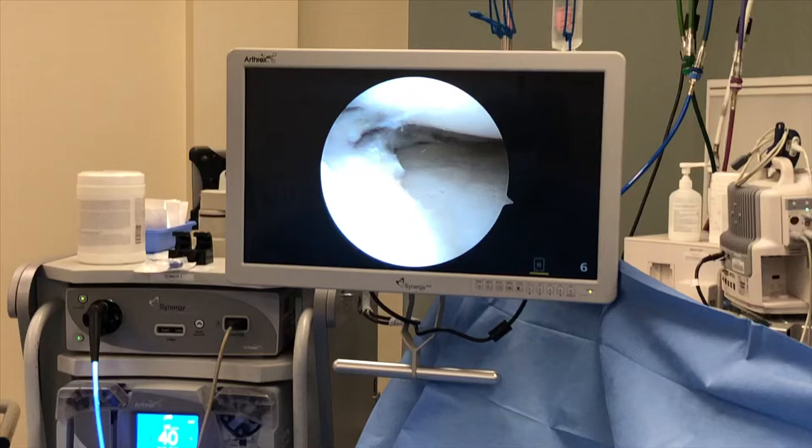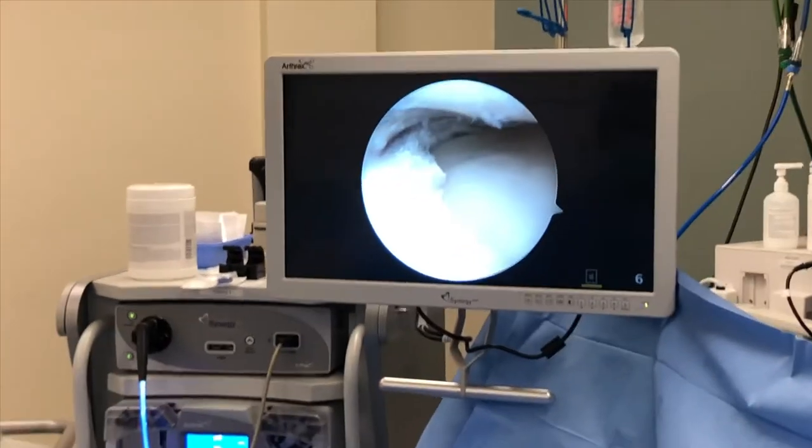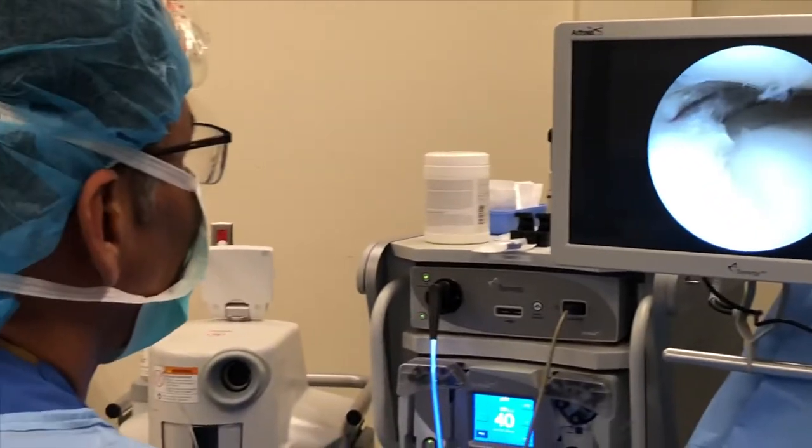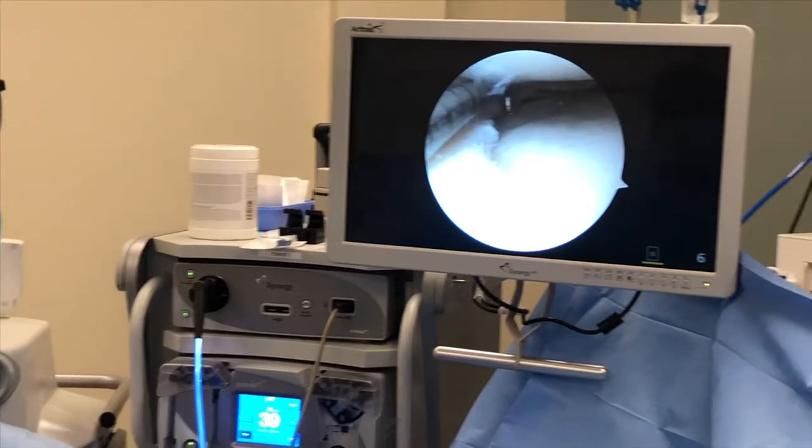I'm going to move your knee a little bit, okay? Just relax. How are you feeling right now? You're doing great. I already saw a tear. I already trimmed it a little bit, but I'm going to look for more.